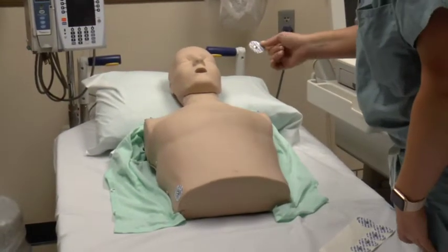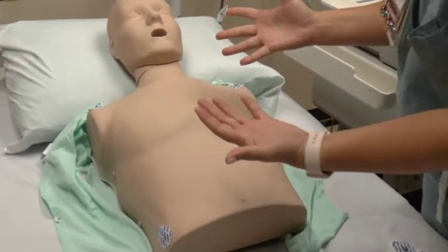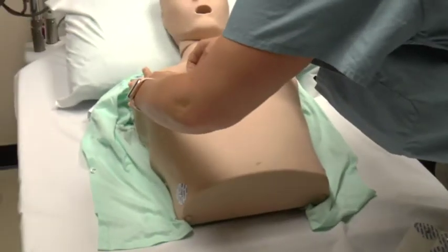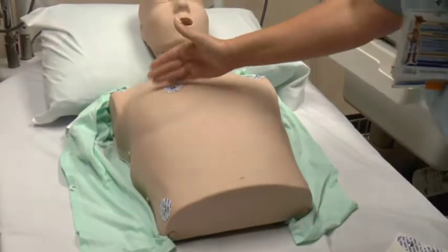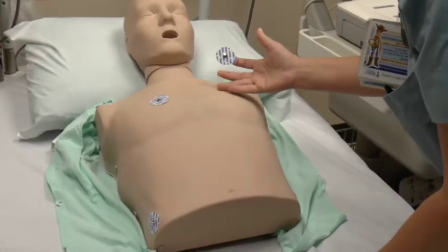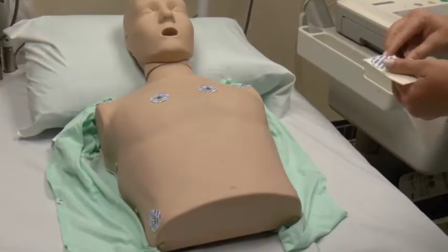For V1 and V2, they need to be on the fourth intercostal space — difficult to measure on a mannequin, but do your best. V1 is directly to the right of the sternum at the fourth intercostal space, and V2 mirrors it on the other side of the sternum at the same level.